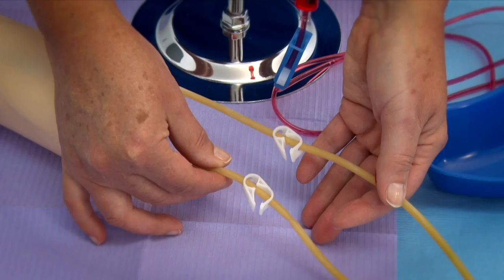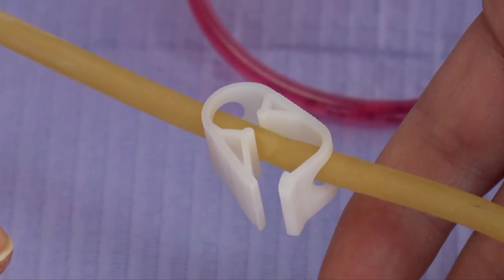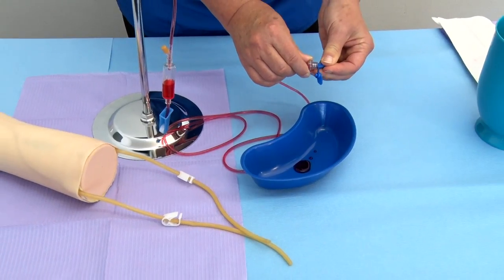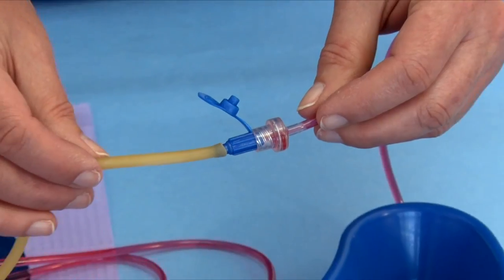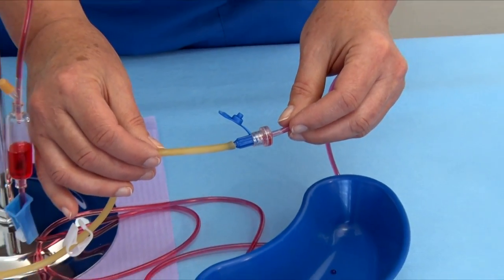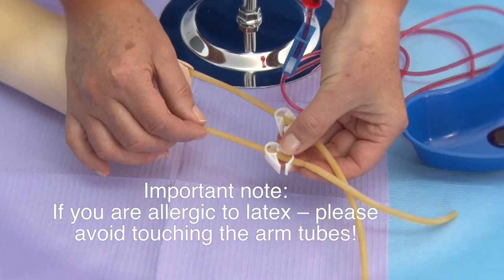Step 15: The arm's latex tubes have clip clamps — ensure that both are open at this stage. Step 16: Attach a connector to the outflow tube of the reservoir container and attach this connector to one of the arm's latex tubes. Step 17: Important note — if you are allergic to latex, please avoid touching the arm tubes.